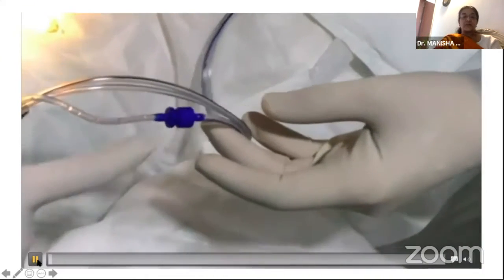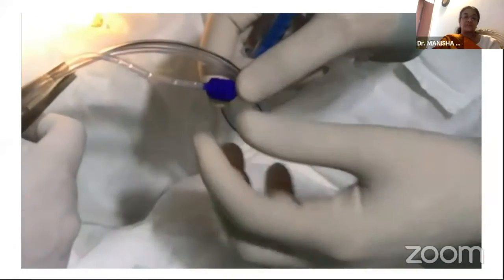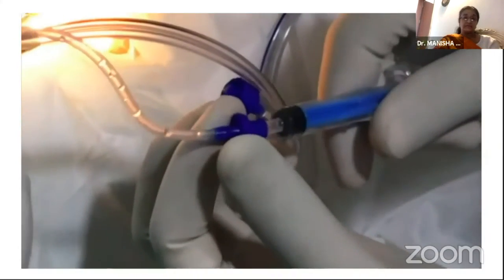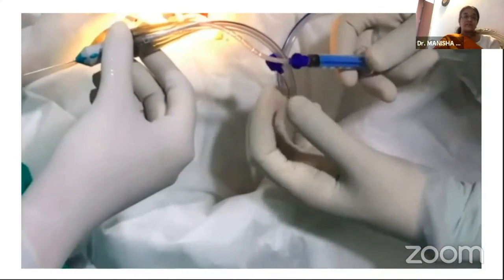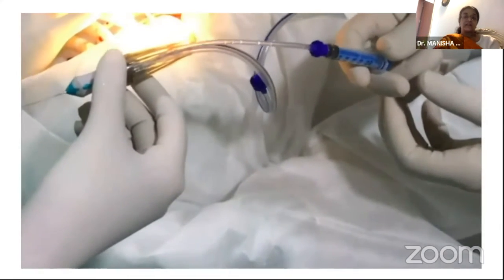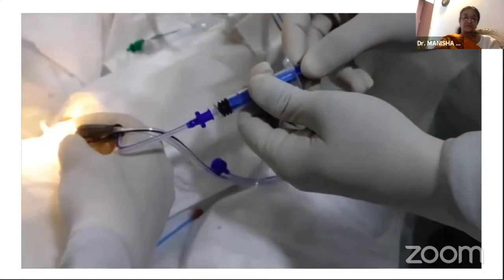So this is just a quick replay of what Dr. Sangeet has already shown. So this is just the cutter. We are just detaching the aspiration line, and we would now be attaching this aspiration port to a syringe. And once you have taken the cutter inside the eye and you have started actively cutting the vitreous, the assistant can gradually collect the sample inside this syringe.